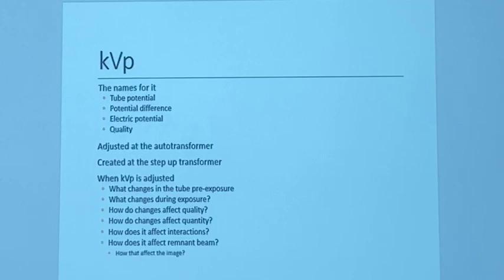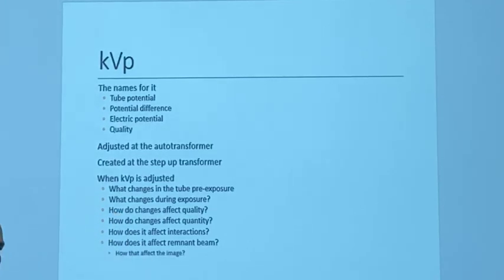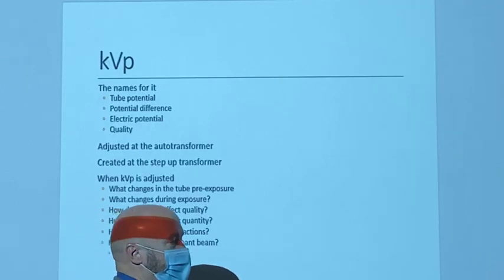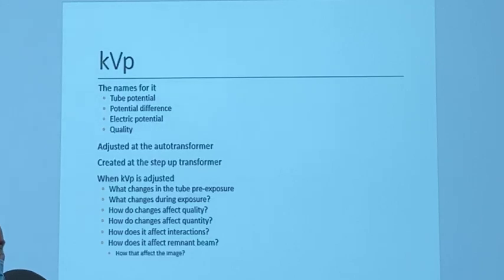Okay, so theoretically, if you increase your KVP by 15%, you increase your exposure and your contrast should go down. Okay, because you get more penetration through all different types of tissue. And it's still registry testable. But the confusion and the difficulty you're going to have in learning this is that in clinicals, it's not going to bear that out very well.